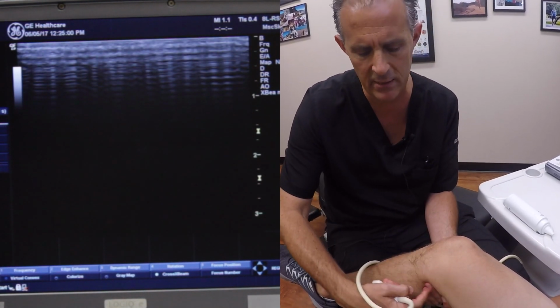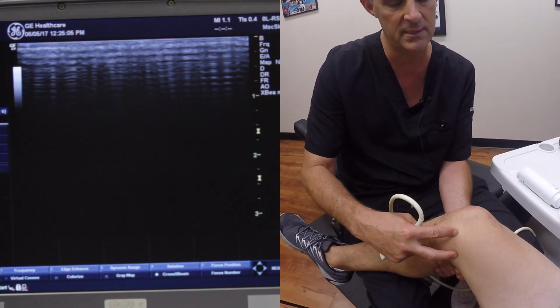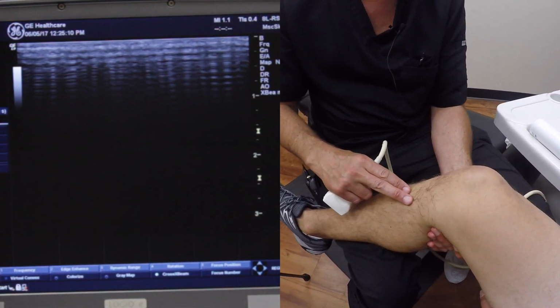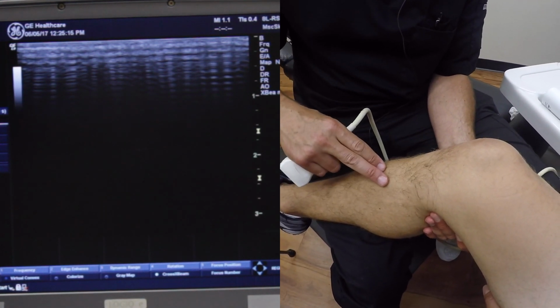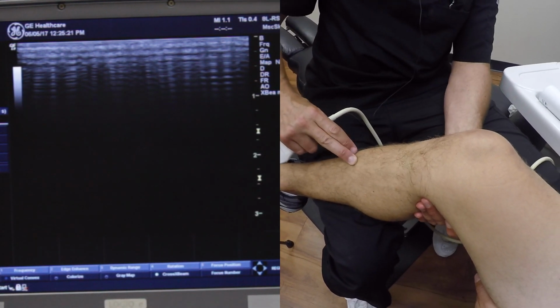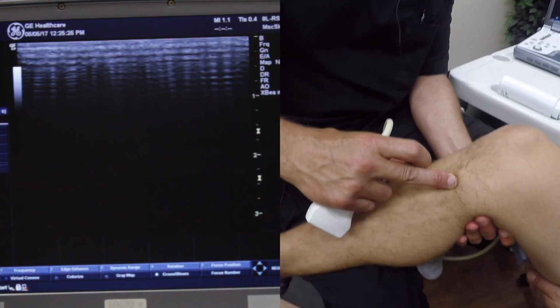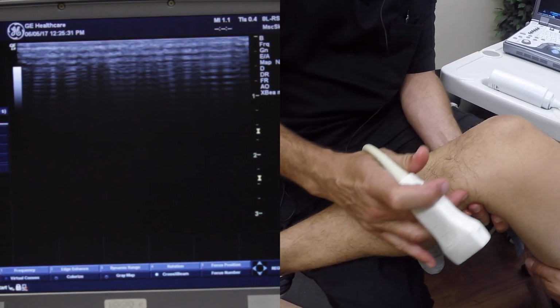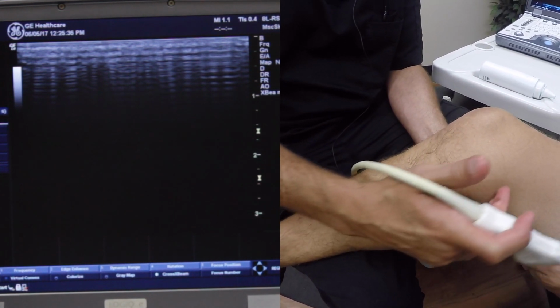So we've talked about medial knee problems, medial collateral ligament, medial meniscus, joint surface, etc. That's what we're looking at here. There's also another thing called the pes anserine bursa. This is a very, very common problem. And where you'll find it is right here where the tibia kind of flares up. So I like to put my hand down on the tibia right here and just follow it up, up, up, boom, right to where it flares. And you'll run right into the pes anserine bursa, right into the spot. Very common site for knee pain, and it's oftentimes confused with medial joint line problems, meniscus, medial collateral ligament.